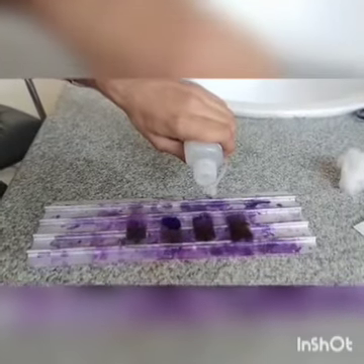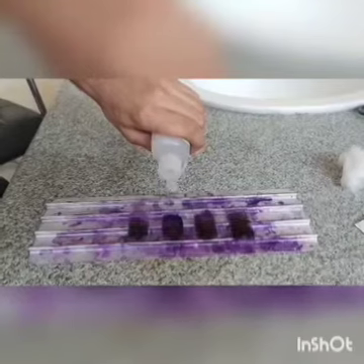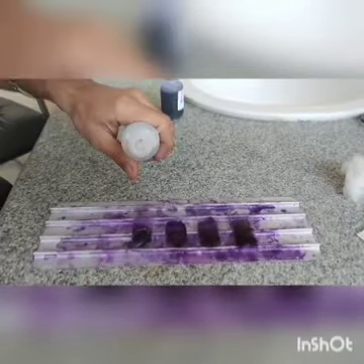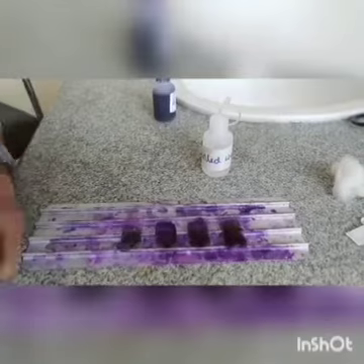No, 11, 12. And wait for 8 to 10 minutes.